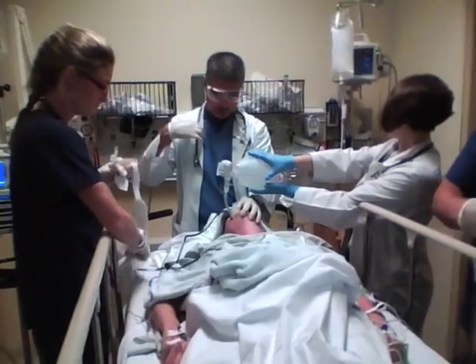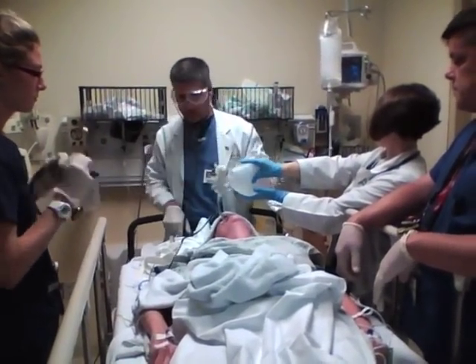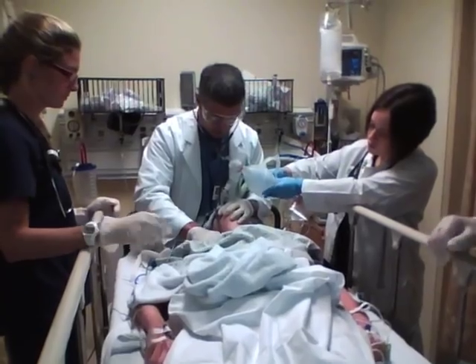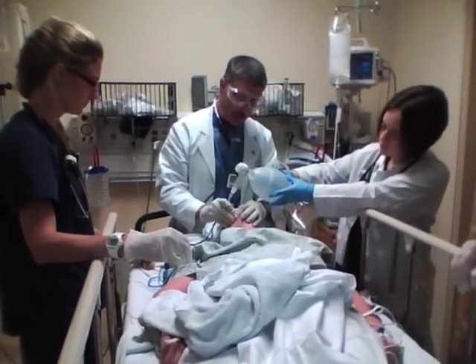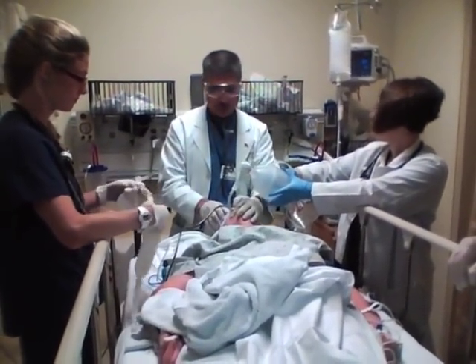We're going to take a quick listen. We have good breath sounds and we're at about 22 at the lip. Our end-tidal CO2 is 41, which is right where we want it to be.